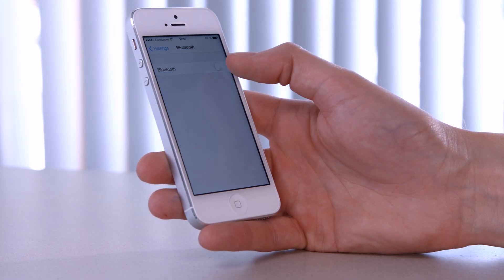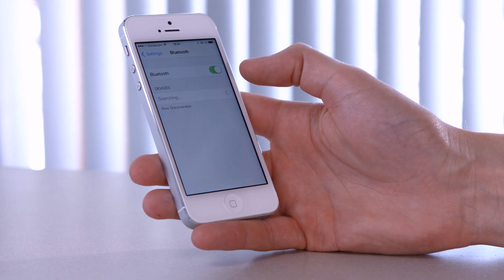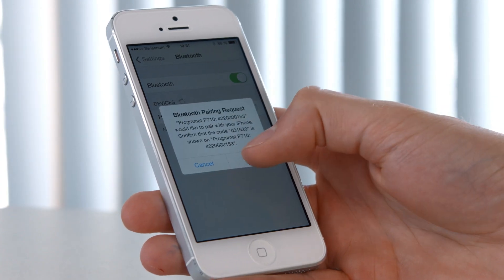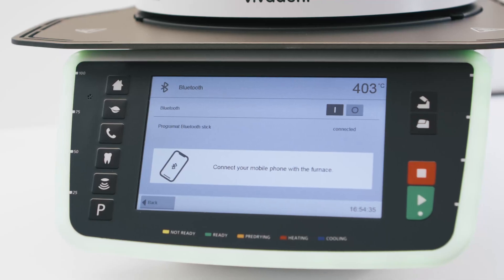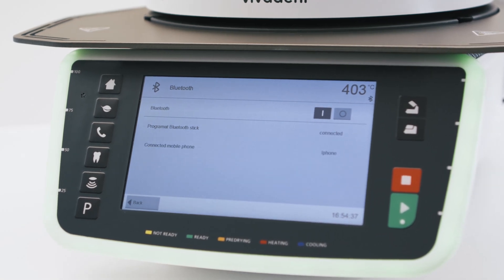Now activate the Bluetooth connection on your mobile phone and start looking for available devices. Select the corresponding furnace. On the display, you can now see that your Programat furnace is connected to your mobile phone.